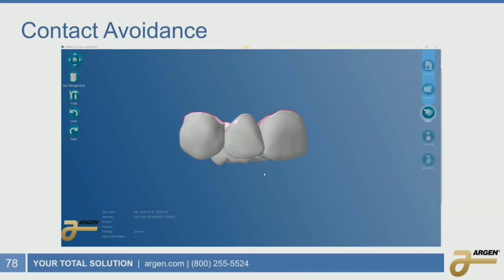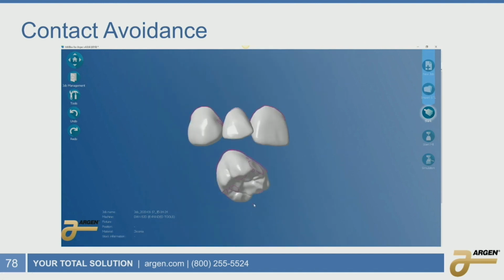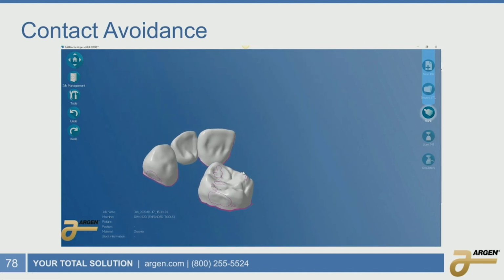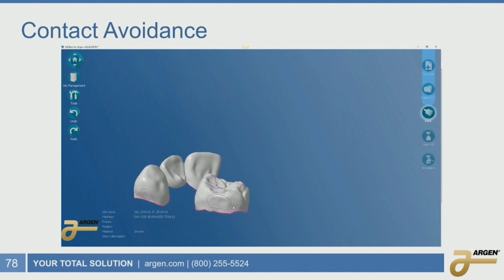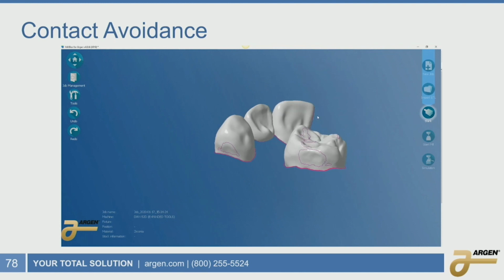And so this is an example of actually what it will look like when you import it within Millbox. So it does not differentiate between occlusal contacts or gingival contacts or adjacent contacts. It just shows that that's where the contact area is. And so I made this on purpose to be high, just to show.